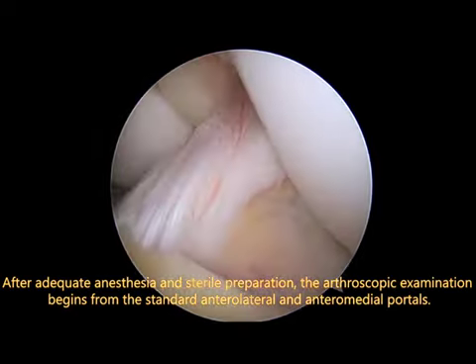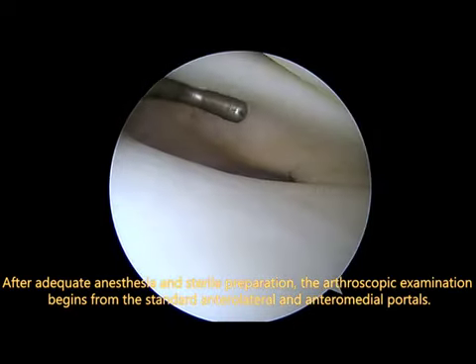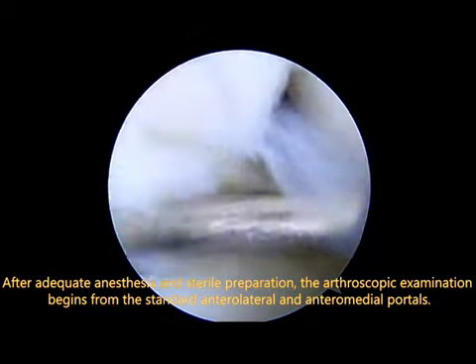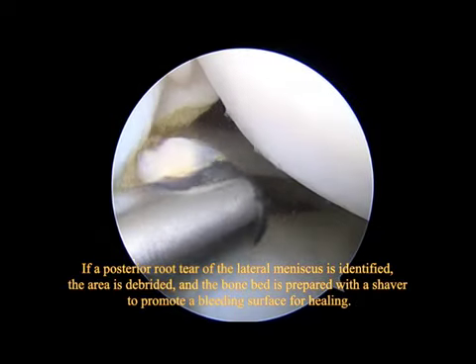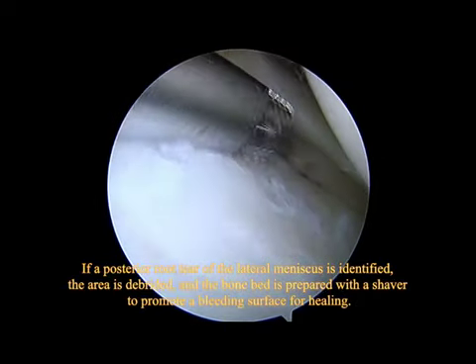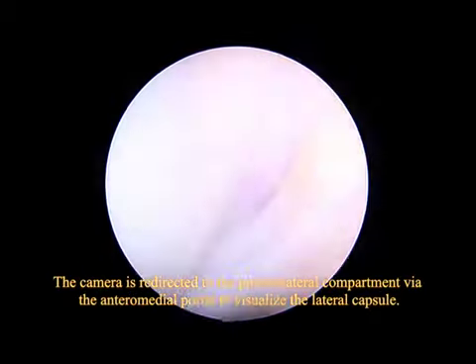After adequate anesthesia and sterile preparation, the arthroscopic examination begins from the standard anterolateral and anteromedial portals. If a posterior root tear of the lateral meniscus is identified, the area is debrided, and the bone bed is prepared with a shaver to promote a bleeding surface for healing.